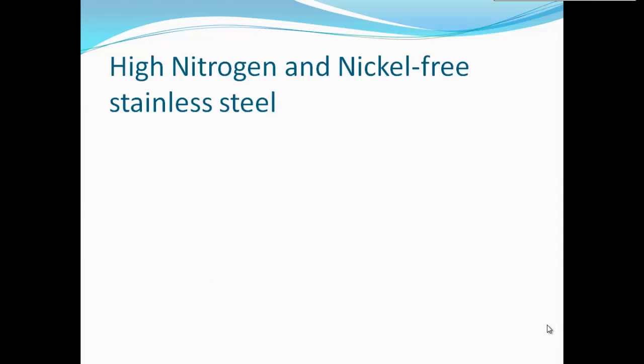Except for surface coating, limiting nickel in austenitic stainless steel is also an efficient way to reduce the allergic response. Nickel release in the human body could potentially cause cancer.